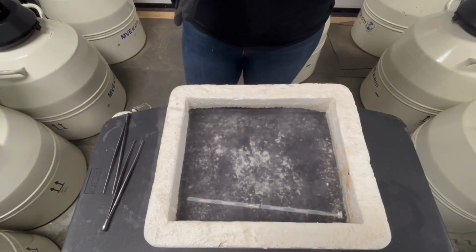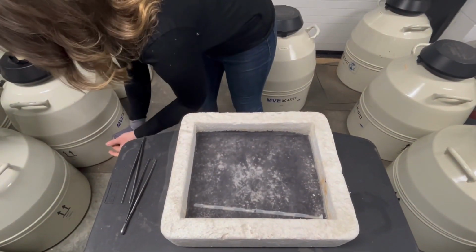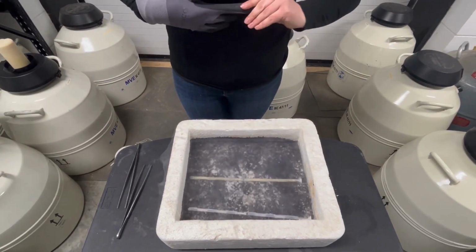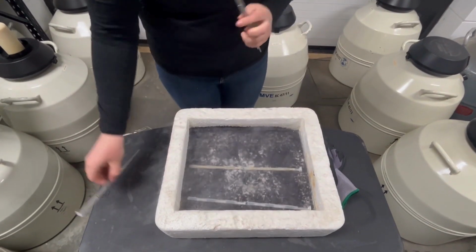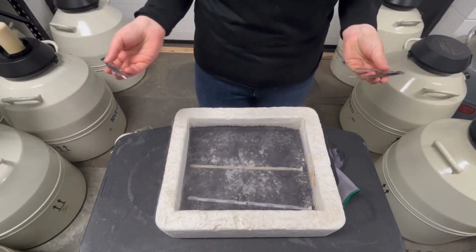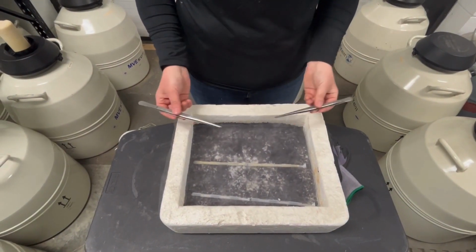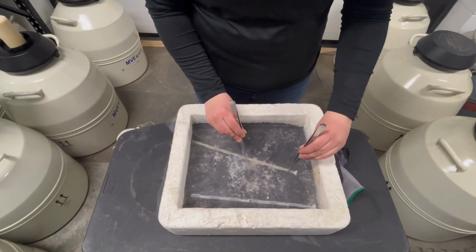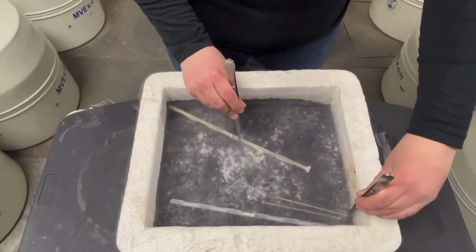So we're going to put our glove on and we're going to pull the semen that we're splitting and put it right directly into the liquid nitrogen. So once again, no longer than 3 seconds, that semen was out of the liquid nitrogen. So the next thing that we're going to do is we're going to pull out the 2 straws that our clients ordered. So these are a pair of forceps. You could also use some long tweezers if you can't find these. So we're just going to hold on to the cane and we're going to pull our 2 straws out. So there's 1 and 2.